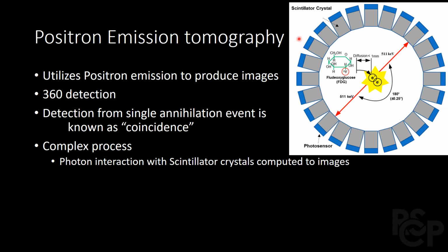So over here is a little diagram of how PET scans work. So as we discussed earlier, FDG is one of the radiopharmaceuticals that is utilized in PET scans. It stands for fluorodeoxyglucose. This is a variant of normal glucose. So over here you have the fluorine here, which is eventually captured in the cells like normal glucose, although it can't undergo metabolism like normal glucose would.